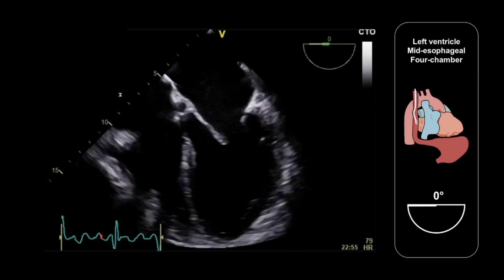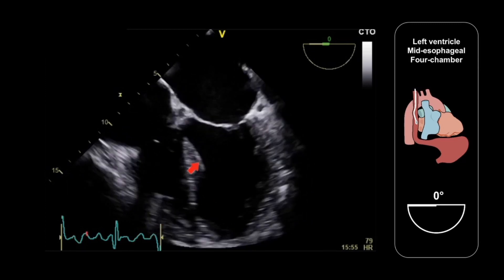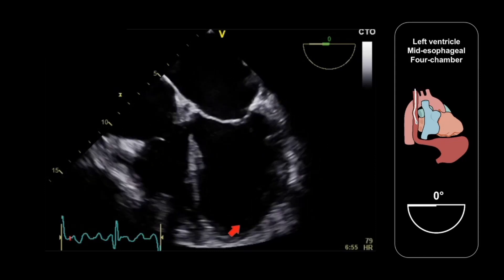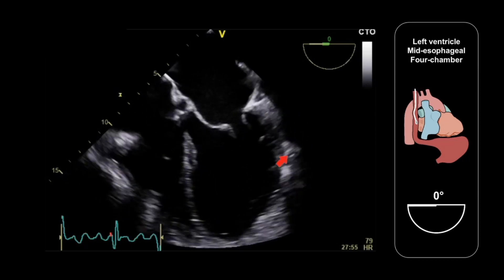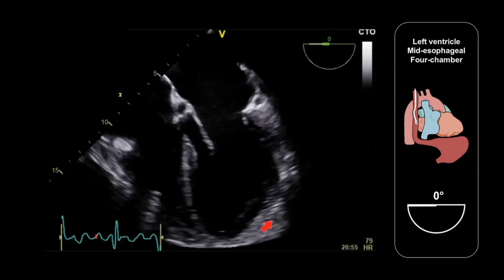We can see all of this on the TEE image here. We can see the basal and mid-infero-septal segments, the apical septum segment, together with the basal and mid-anterolateral segments, and the apical lateral segment.